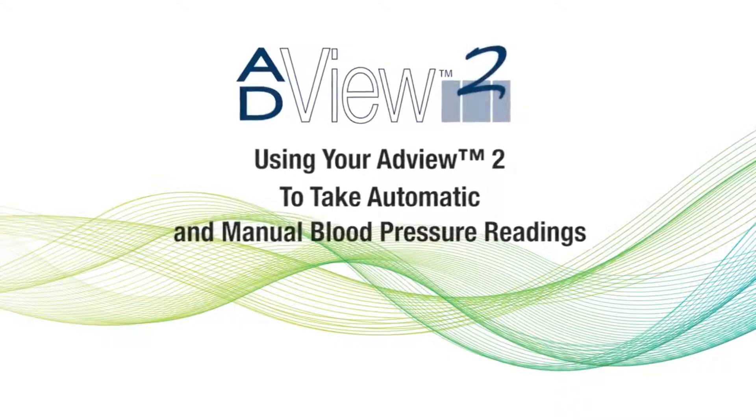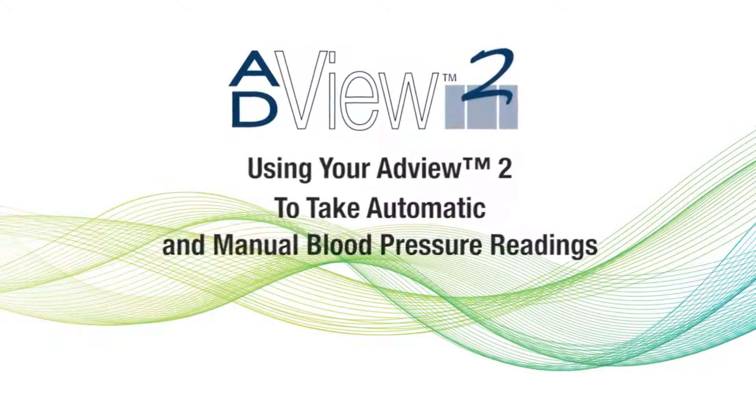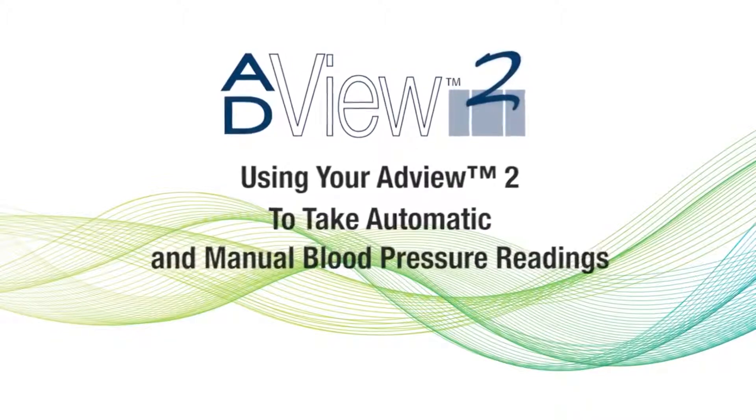In this video, we'll show you how to take a single automated blood pressure reading, as well as a manual blood pressure reading, using your AddView2.